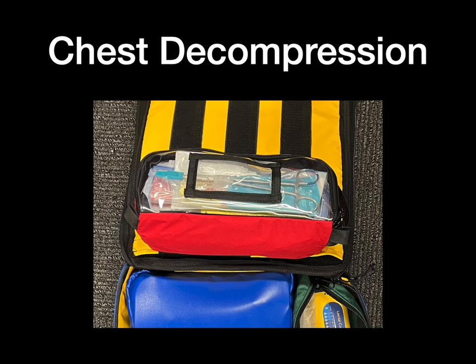The chest decompression pouch contains forceps, a scalpel, and chlorhexidine bundled together for an open or finger thoracostomy, as well as 2 Russell pneumofixes, and Portex intercostal catheter bags. The size 12, 20, and 32 ICCs themselves are laid flat along the bottom of the blue pack.